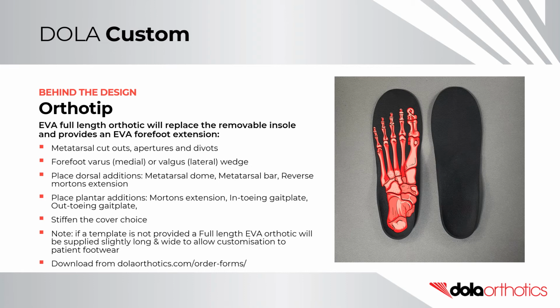Note: if a template is not provided, the full-length EVA orthotic will be supplied slightly longer and wider to allow for customization to the patient's footwear.